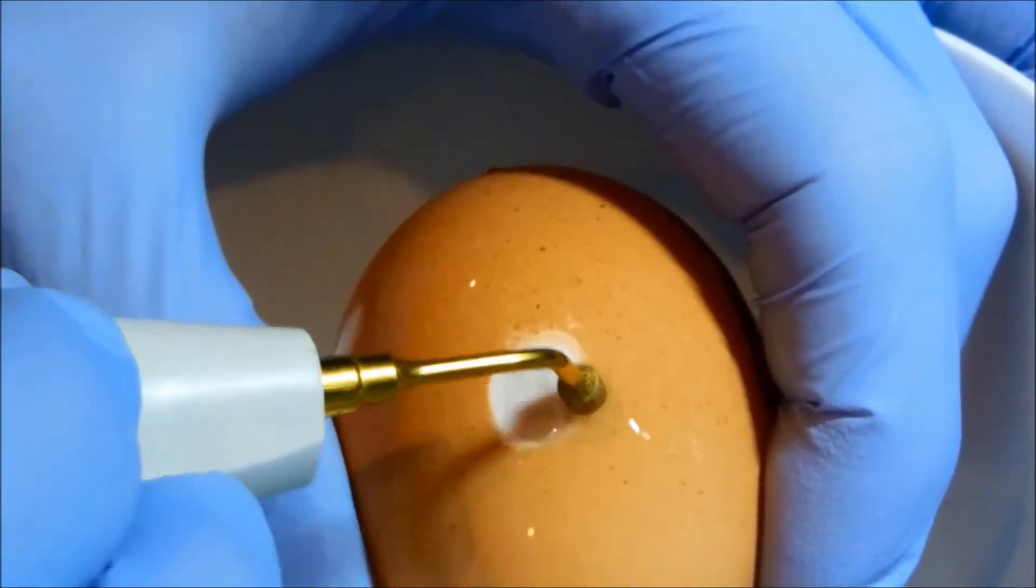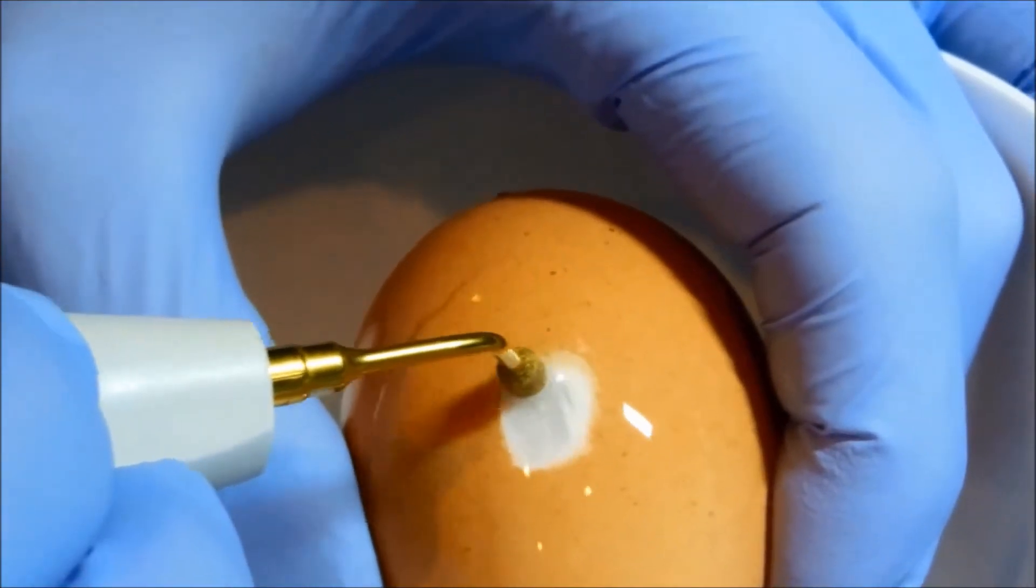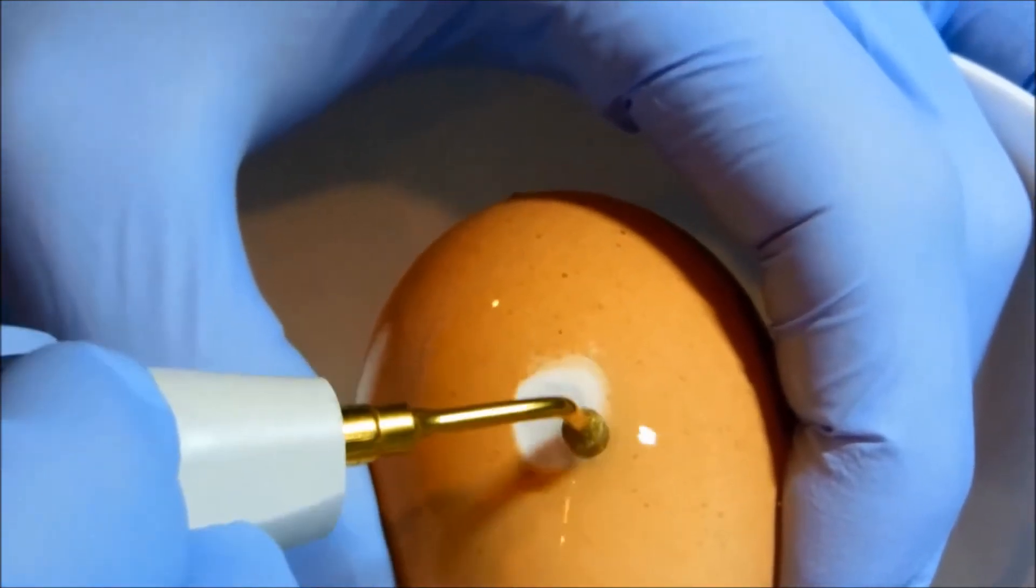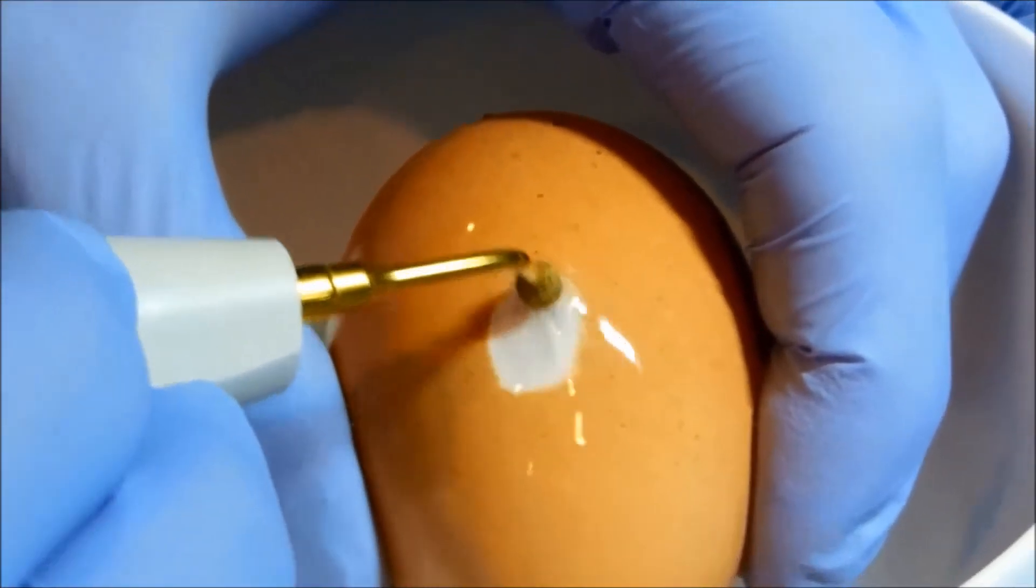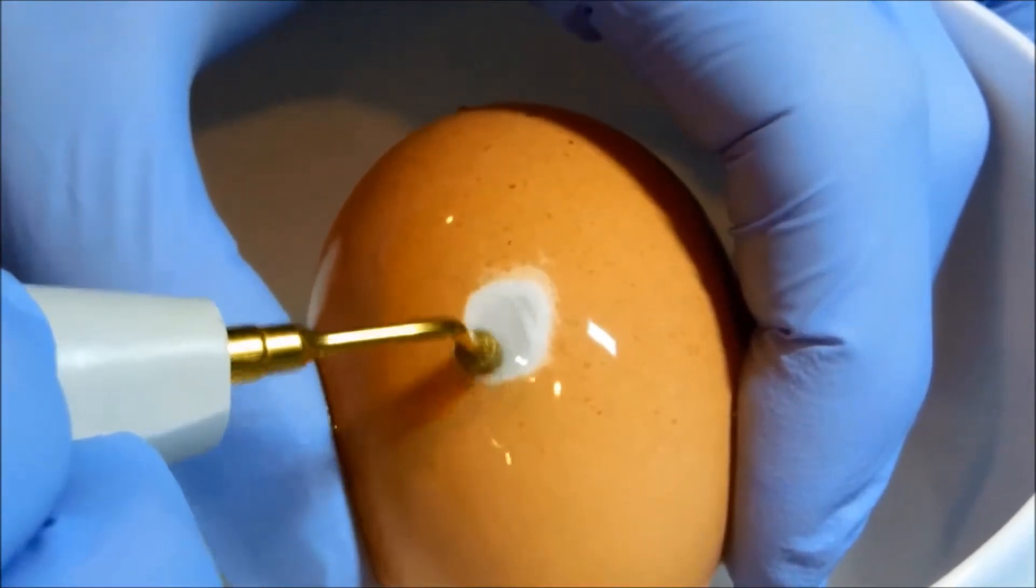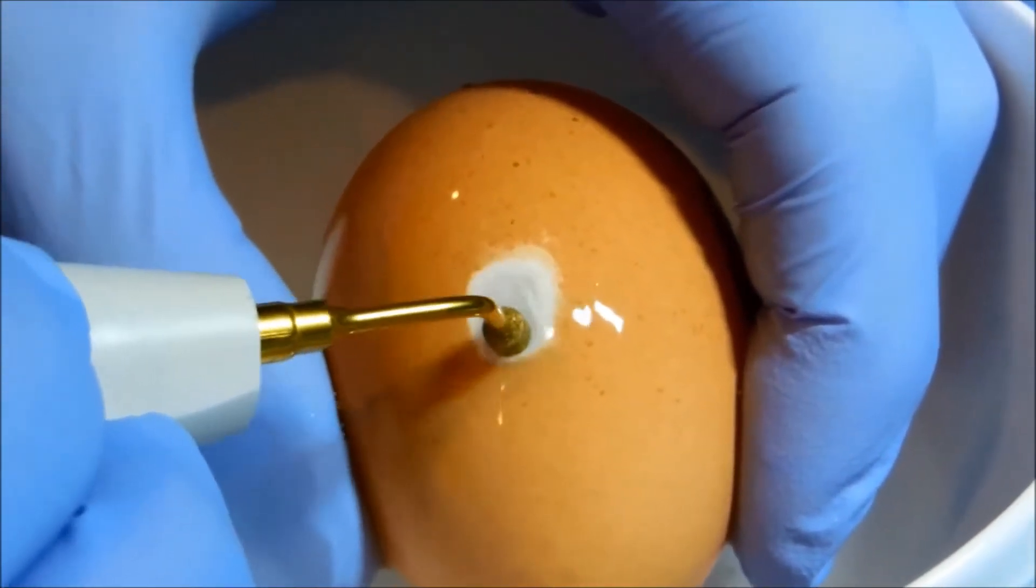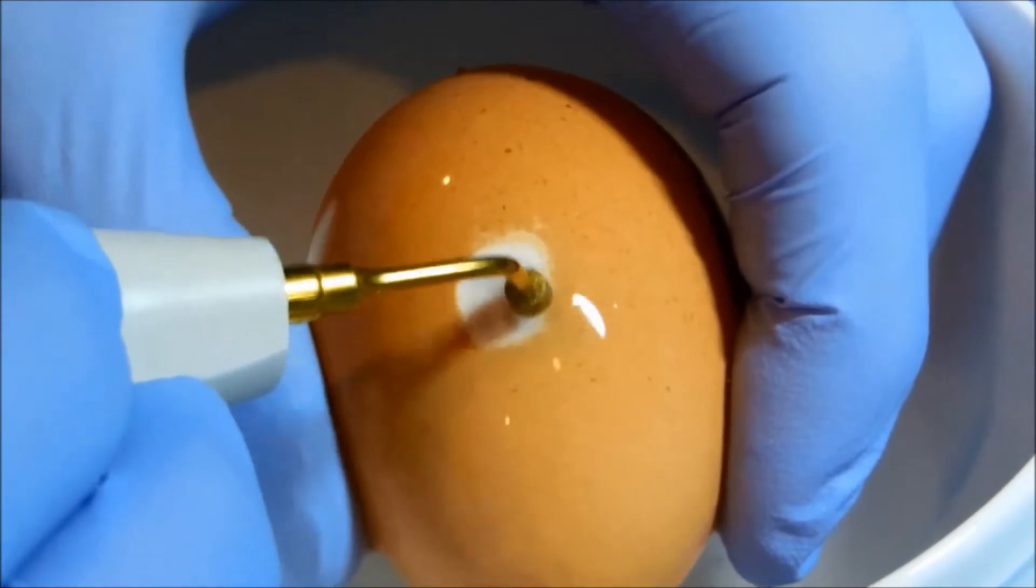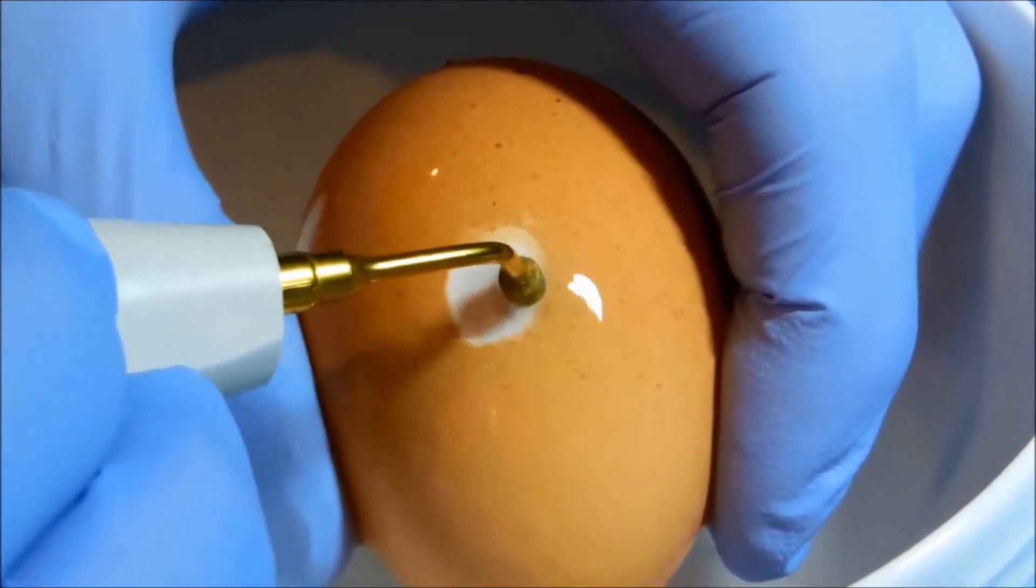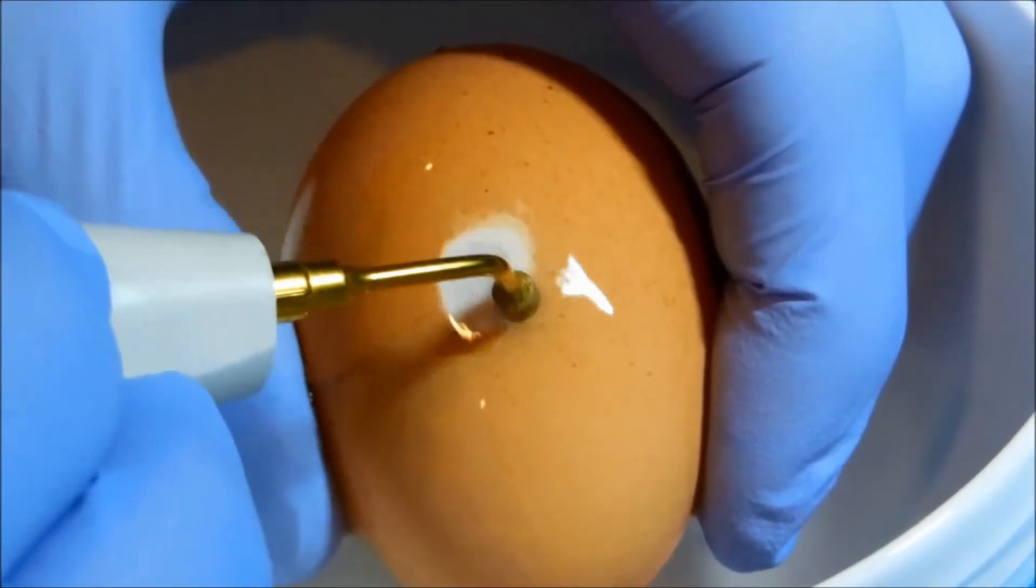So here we are. What I've done is really expanded and made this slightly bigger. You're starting to see how we've removed the shell. This is starting to become the soft part. And this is exactly what we do as we elevate the sinus.